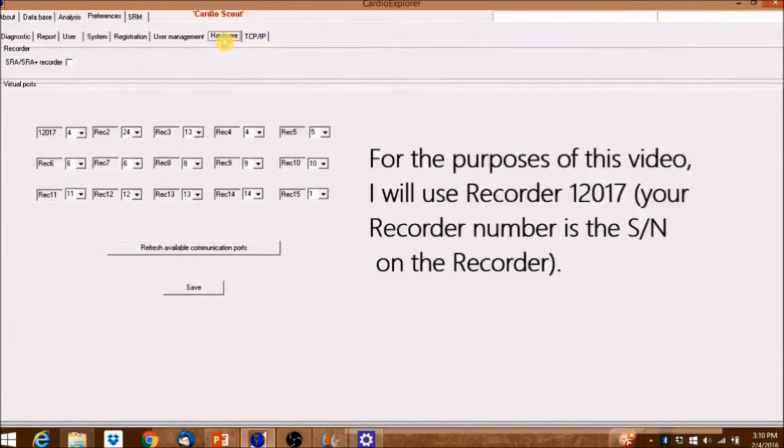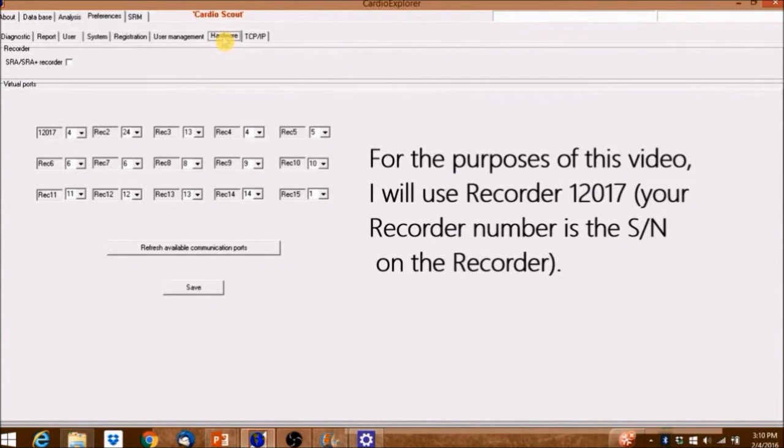For the purposes of this video, I'll use Recorder 12017. Your recorder number is the SN on the recorder.